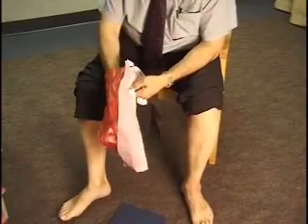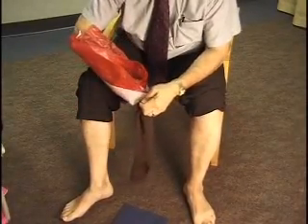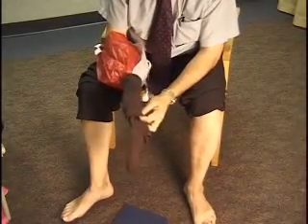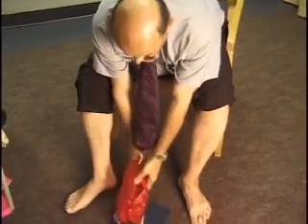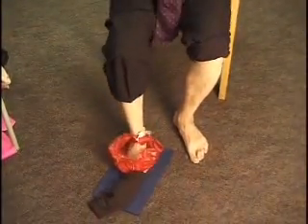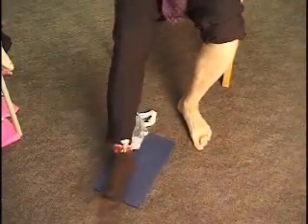A closed-toe stocking can be donned using an applier as seen here. First, the stocking is placed over the applier, which has snaps at the bottom and top, which later will be removed to facilitate removal of the applier. It is important to make sure that the applier goes over the heel along with the stocking to facilitate application of the hose to this point.